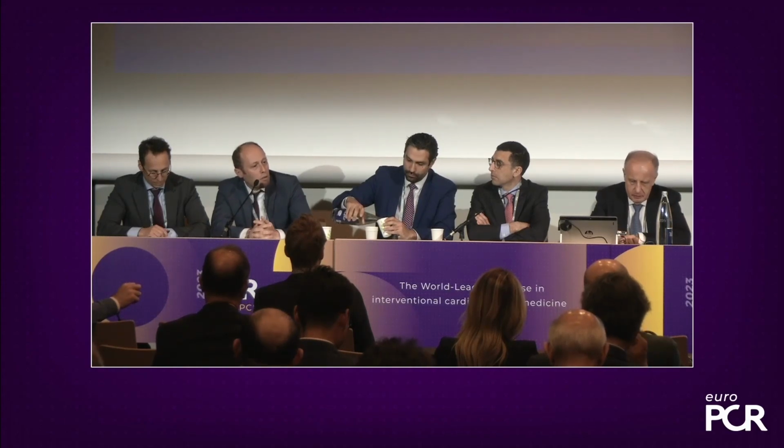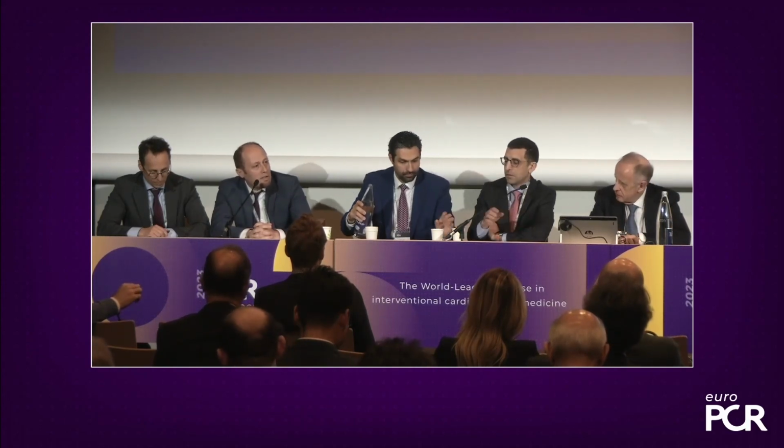Thank you, Emanuele. I believe that new tools are really important to support the penetration of coronary physiology because, for example, in Italy, but also in other countries, the systematic application of coronary physiology to indicate and to guide revascularization is very low. So any tool that can improve the penetration of coronary physiology, and so the possibility to improve the outcome of our patients, is really appreciated. A microcatheter can probably be more familiar for a lot of operators, and allow an increase in the number of assessments in daily practice.